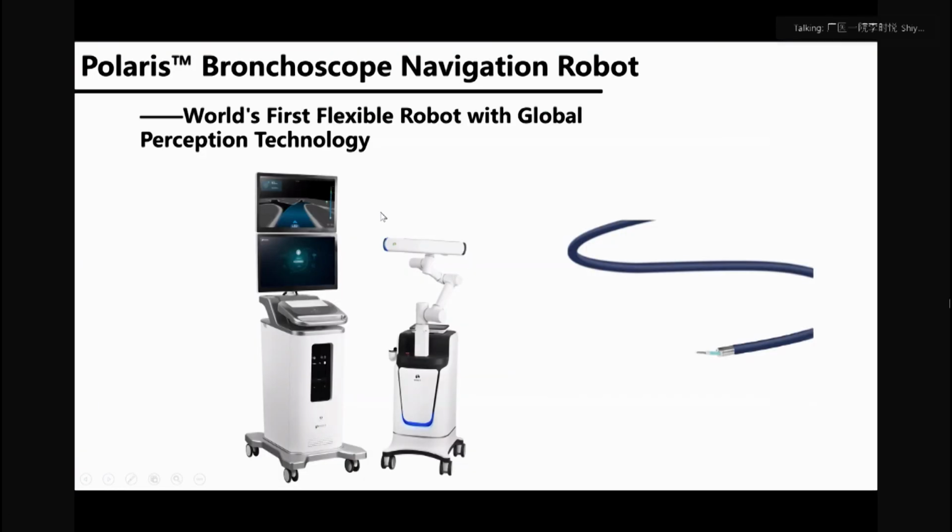For this case, the robot we are using is the Chinese-made Polaris bronchoscopy navigation robot. This is a Chinese-made robotic system. It has recently become commercially available.